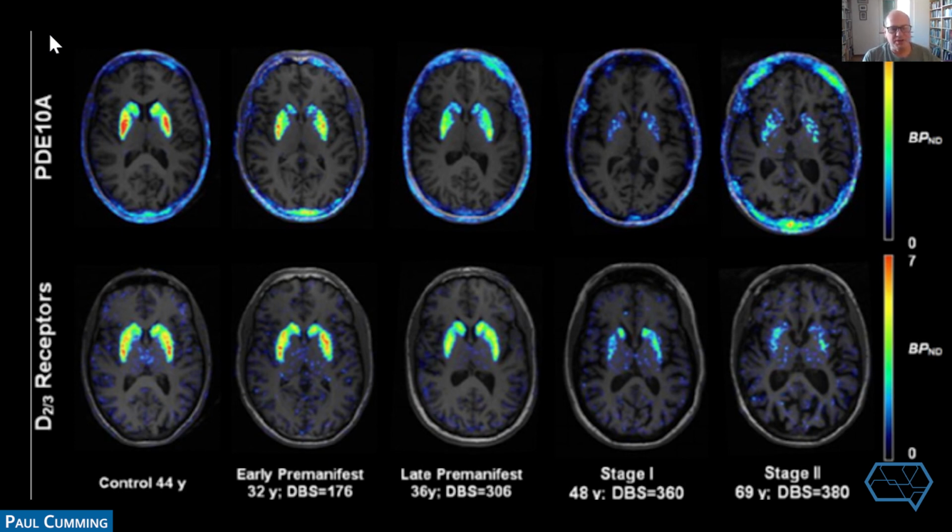But it shows that there's a very broad spectrum of different aspects of neurotransmission that are affected in Huntington's. My main summary point is that there is a pre-morbid, pre-manifest pathology that can be detected by PET even before the neurological and psychiatric symptoms of Huntington's declare themselves. And really, my last statement would be that unless somebody comes up with a treatment or an intervention, Huntington's inexorably proceeds to this very horrible state of the nervous system where really nothing works. And certainly the dopamine system is completely messed up.